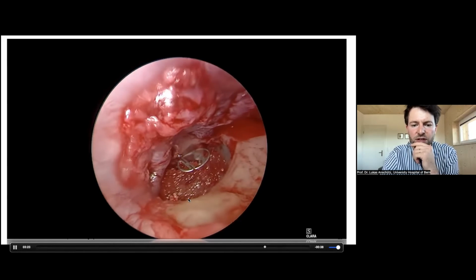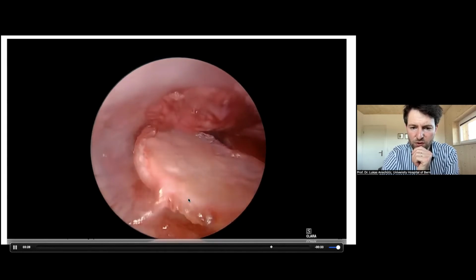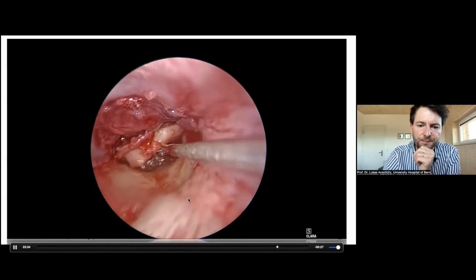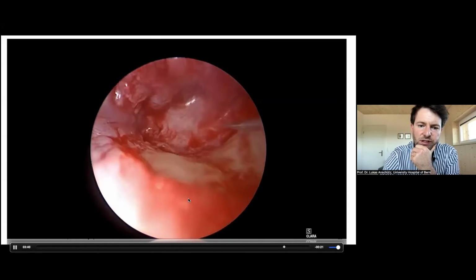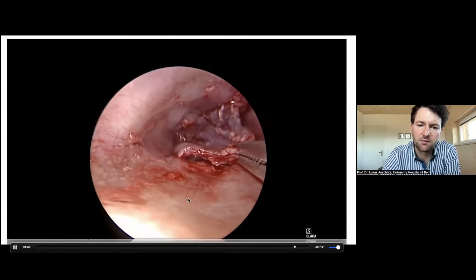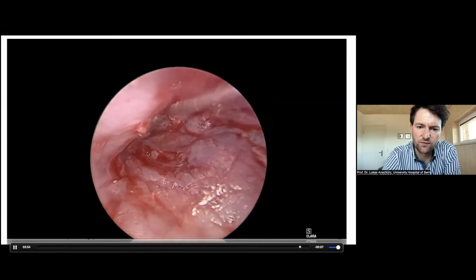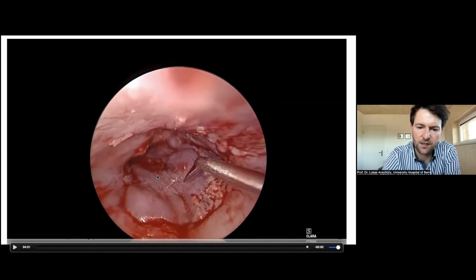The granulation tissue in the eardrum, I removed it, so there is a hole, and that's why I wanted to put a rather large piece of cartilage inside, because the main aim here is really to close up. You can see I close the situation, the cartilage goes on the prosthesis. I can check again that it is still in a good position, and then I can put back my flap, and you can see here was the granulation tissue, which I removed, and now we see the cartilage below, and the flap can be repositioned, and then the dressing of the drum.